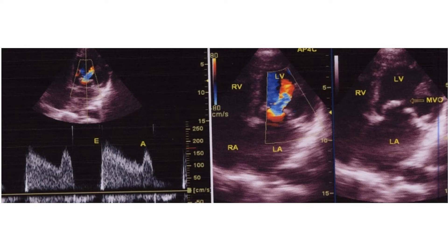A mitral valve area of 1 square centimeter corresponds to a PHT of 220 milliseconds. Hence, dividing 220 by the measured pressure half-time gives the estimated mitral valve area by PHT. In severe mitral stenosis, the slope is flat and the pressure half-time is longer, giving a smaller area by PHT.